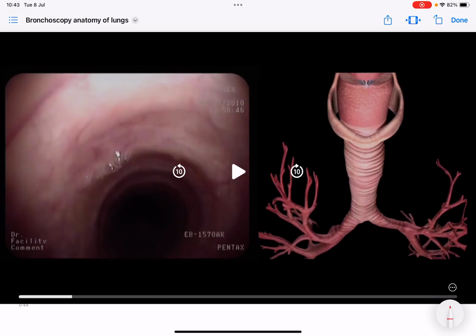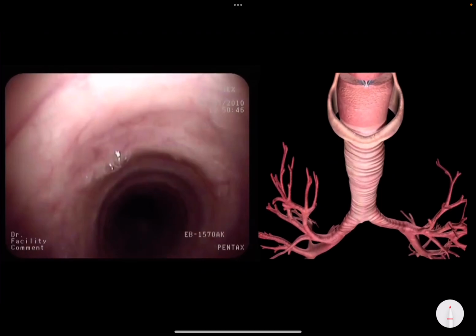When entering inside the vocal cords, we will see a structure known as the trachea. The trachea is covered anteriorly by cartilage and posteriorly by a fibromuscular structure. This is an incomplete C-shaped cartilage, which protects the trachea from collapse from nearby structures. The posterior part is not covered by cartilage, so it looks like a muscular layer. This is the fibromuscular layer, which bulges anteriorly during coughing.